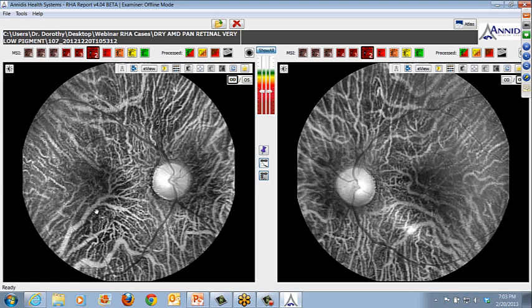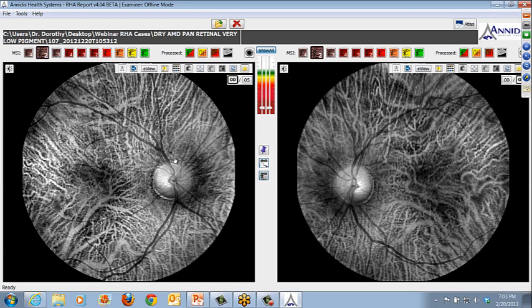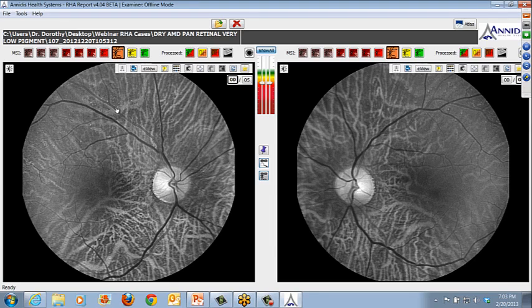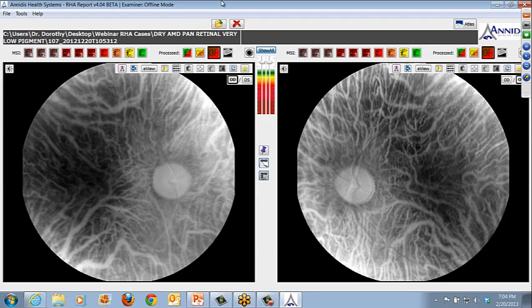And there's virtually, I don't want to say none, but there's very, very little RPE pigment reserve in both maculae. And as you go to 3 and 4 down into the choroid, you can really visualize the choroid, again, because there's not a lot of pigment blocking. You'll see a lot of Caucasian patients like this. And so this patient has low pigment reserves, lots of hard drusen. Yes, they're not in the macula, but in fact, this is still macular degeneration by definition. Perhaps this patient is a little bit lower risk because the location is not parafoveal. Okay.